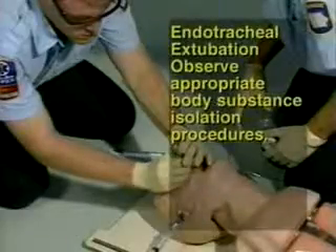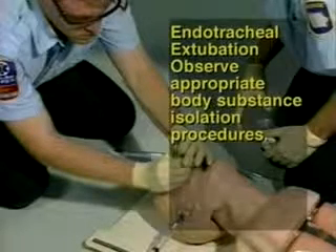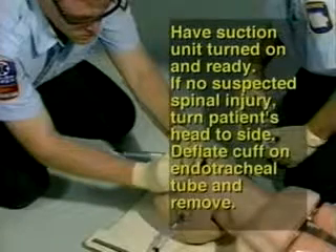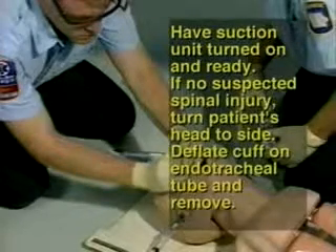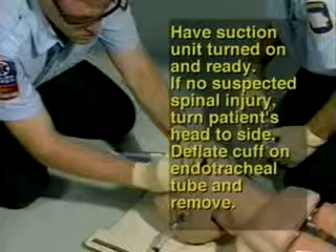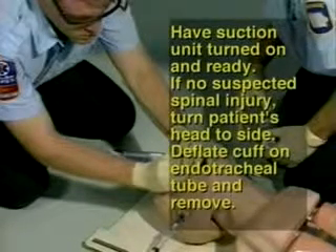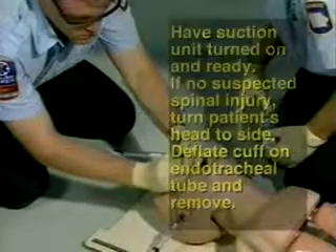Endotracheal extubation. Step 21: Observe appropriate body substance isolation procedures. Step 22: Have the suction unit turned on and ready. Step 23: If no suspected spinal injury, turn the patient's head to the side. Step 24: Deflate the cuff on the endotracheal tube and remove.